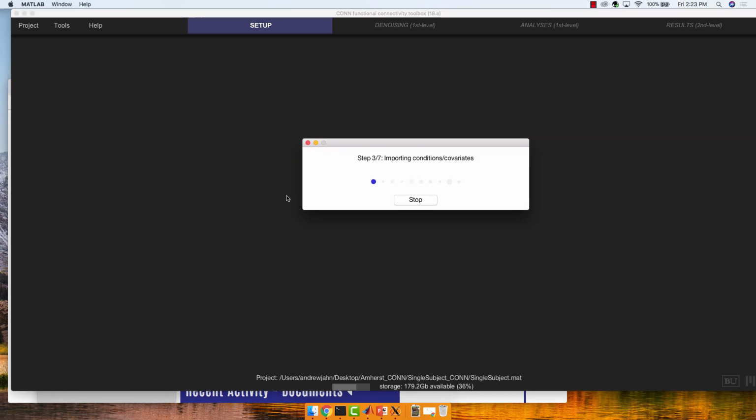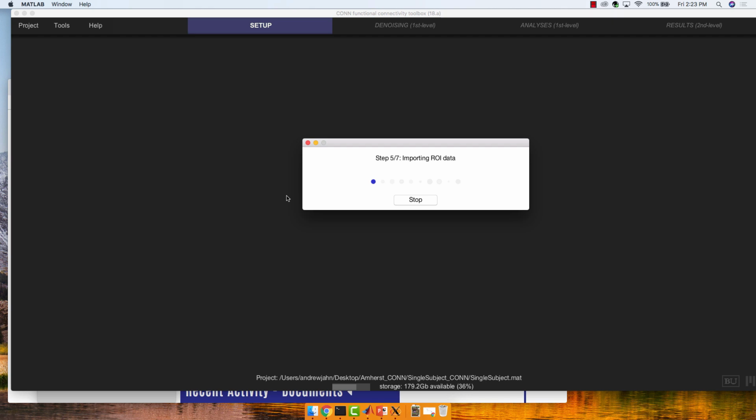Does CONN toolbox automatically parallelize processing-wise? I mean, 4 cores. Yeah. 4 of them. I don't know. I know that in AFNI you have to specify that if you want to. I'm not sure what CONN does. It seems to run pretty fast. So would you have a cluster? Do you want to put the script? Yeah. If you had a lot of subjects. For this sample thing, we have 25 subjects. My computer takes a little over 2 hours, which is why I'm going to recommend that people do that overnight. If it doesn't work, that's fine. You can just get it off my hard drive.